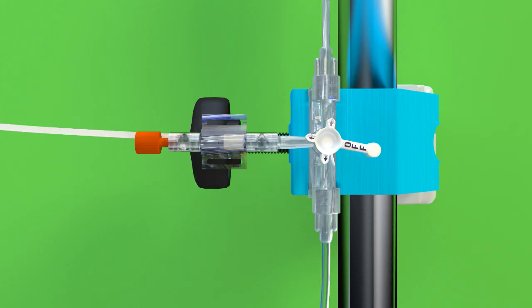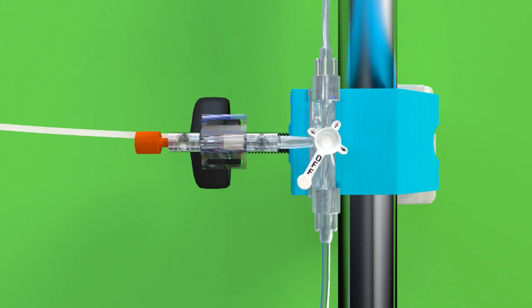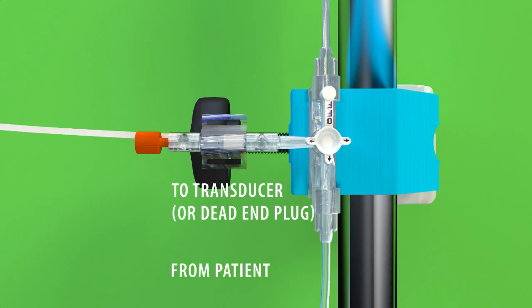If the OFF position is rotated toward the transducer site or dead-end cap, fluid from the patient stopcock will flow to the drip chamber only. If the OFF position is rotated toward the patient line stopcock, fluid flow from the patient line would stop, inhibiting flow to either the transducer site or dead-end cap, or to the drip chamber. Finally, if the OFF position is rotated toward the flow chamber position, fluid from the patient line stopcock flows to the transducer adapter or dead-end cap, but is inhibited from flowing to the drip chamber.